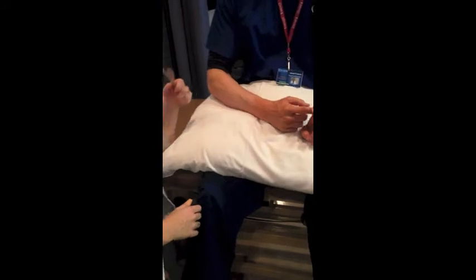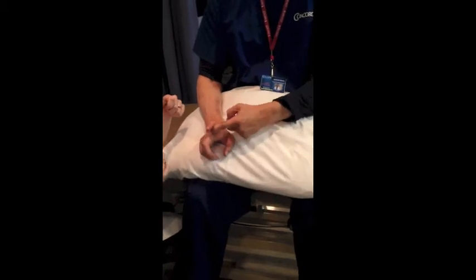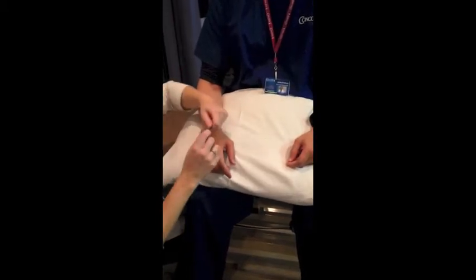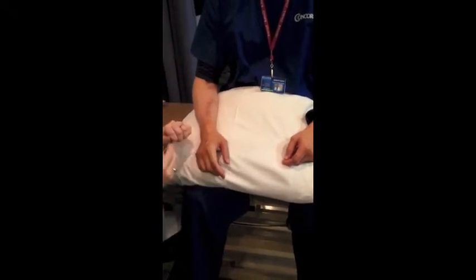Does it matter if the finger is like this or like that? We are just doing the first joint, so you don't want to stretch out the other ones. I'm going to say it's just under 90.